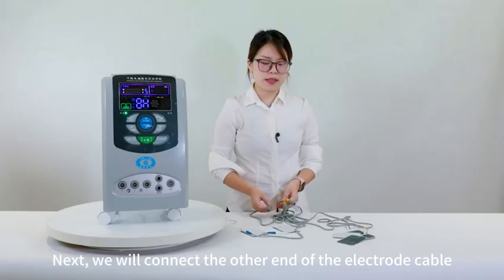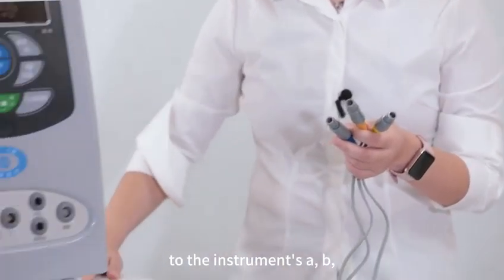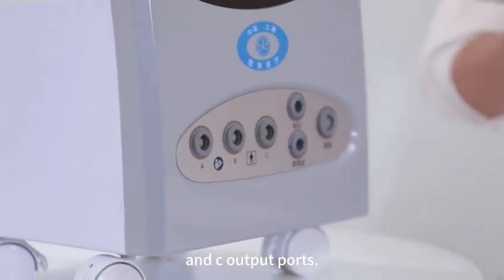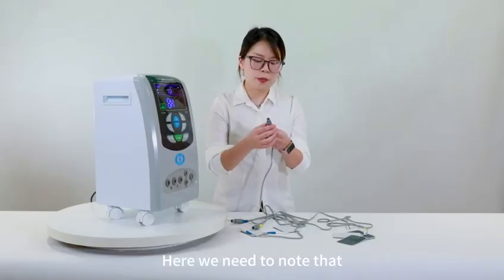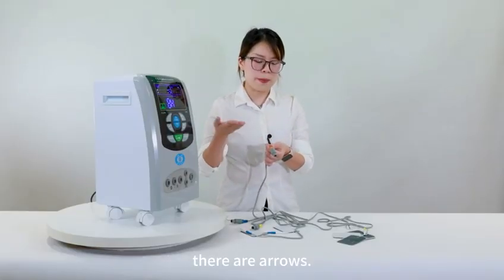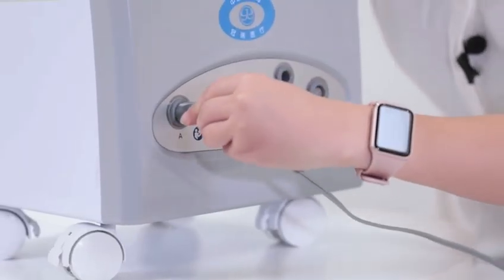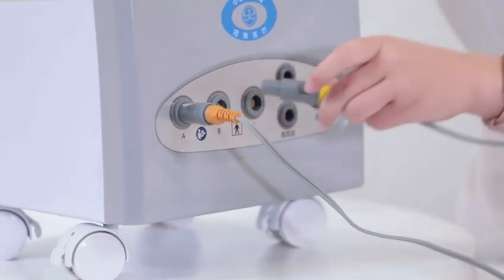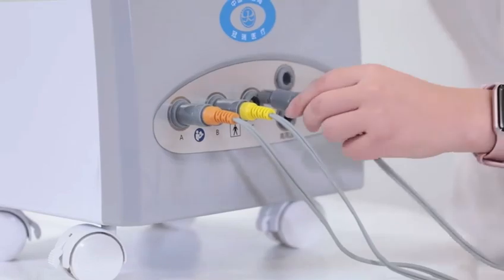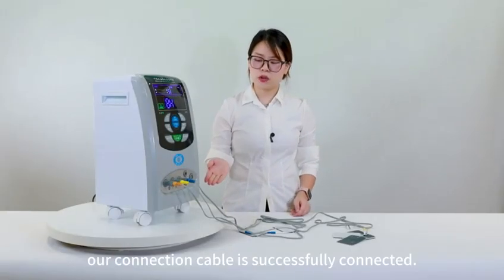Okay, next we will connect the other end of the electrode cable to the instrument's A, B, and C output ports. Here we need to note that on the other end of our connecting cable, there are arrows, with the arrows pointing up. Like this, our connection cable is successfully connected.